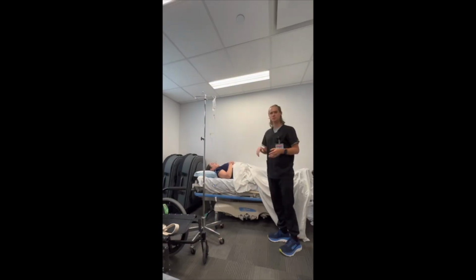An orientation to management of lines and tubes in the acute care setting. So what we're going to be doing is going through a couple of small cases here and demonstrating some of the techniques that we're going to talk about, and basically all in all just talking about what we can do to avoid mistakes when we're first entering our rotations or jobs in the acute care setting.